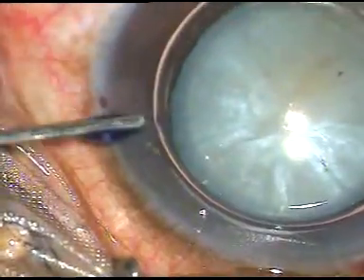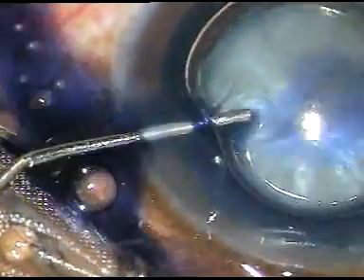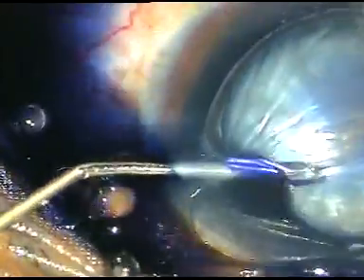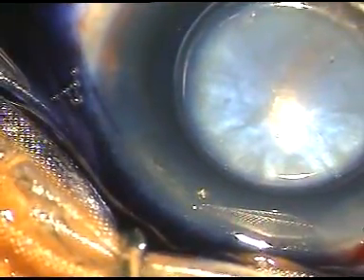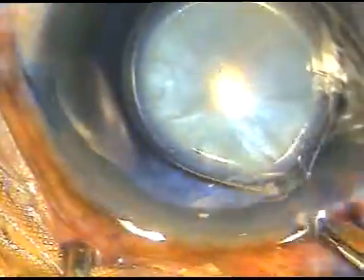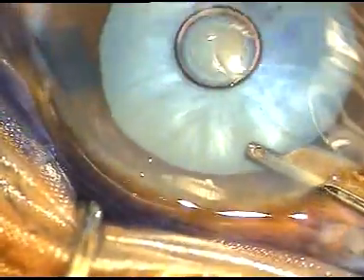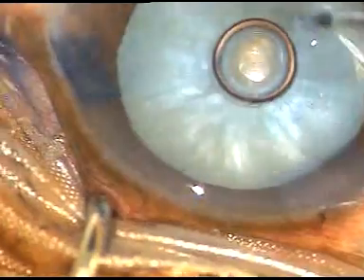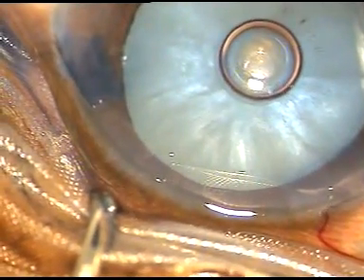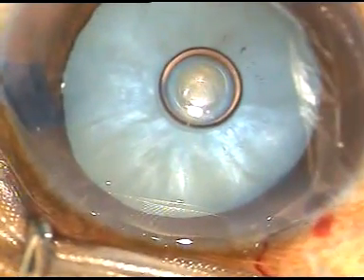Dear colleague, this is an intumescent cataract done today, 24th January 2017. We know in intumescent cataracts the main challenge is to do capsulorhexis because there is high intralenticular pressure, and if we try to do capsulorhexis without taking proper measures, the rhexis margin can run to the periphery towards the equator.